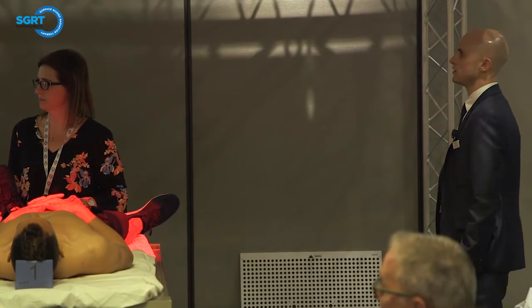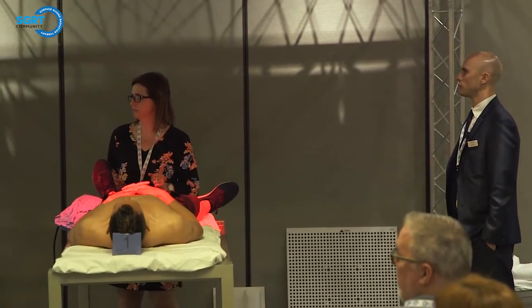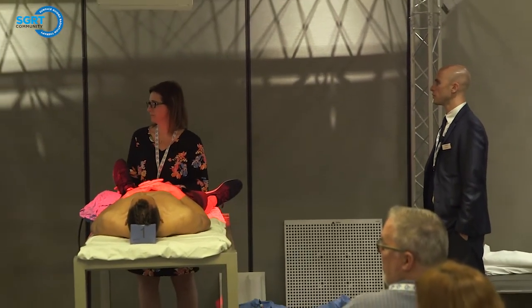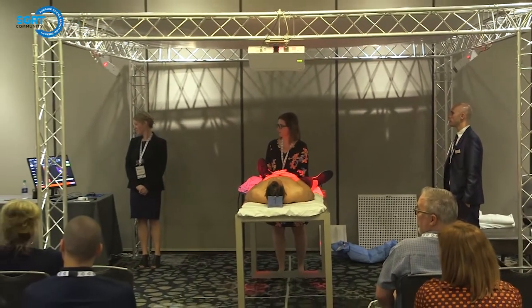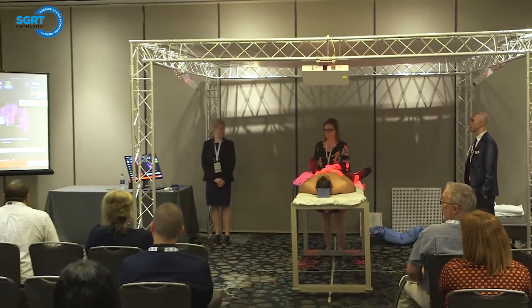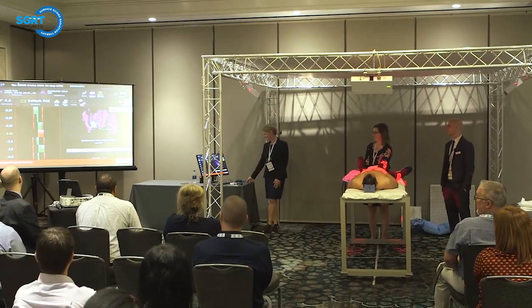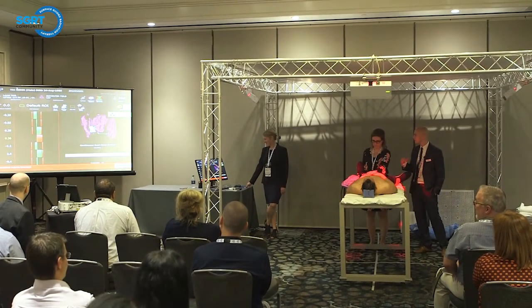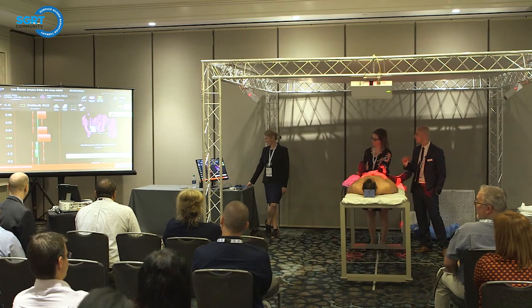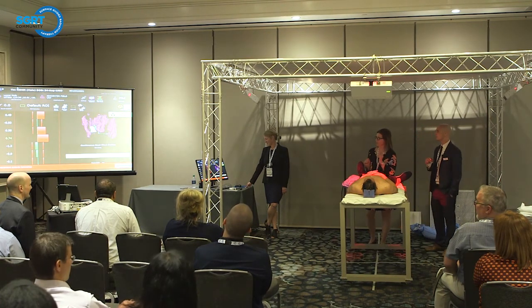Her pitch is really good. Rotation and roll are getting there. We can maybe roll just a little bit, but he's all within tolerance. Let's see if we can get it less than 0.1 with that roll maybe. We were there. I think he moved on us. Go ahead and grab his foot and rotate it to the left. Yeah, there you go. Awesome. It's very, very sensitive. It's a degree of movement, but it really isn't much.